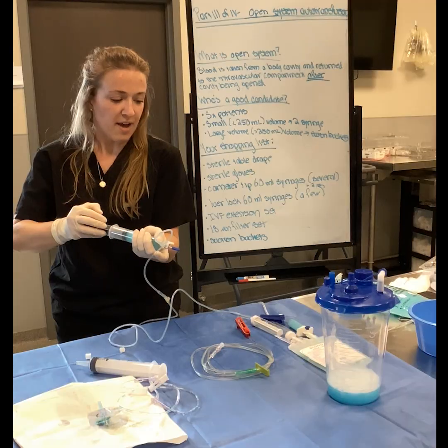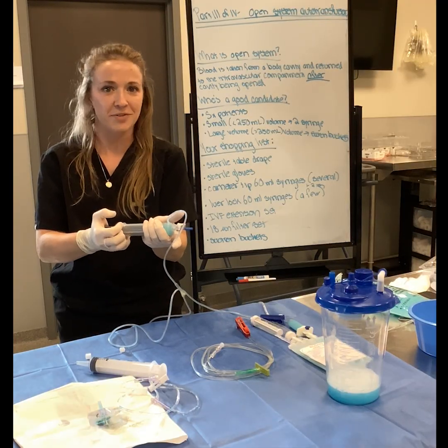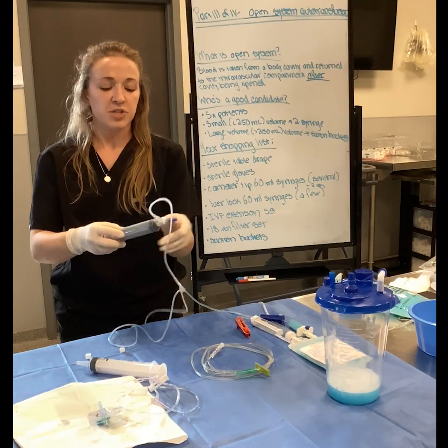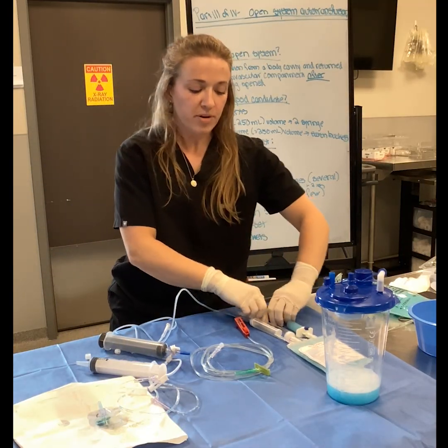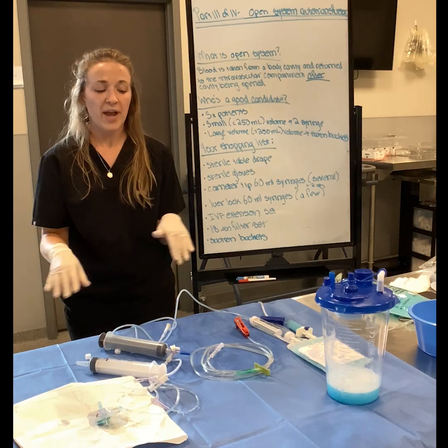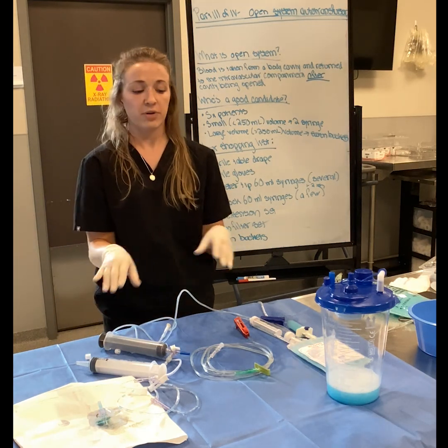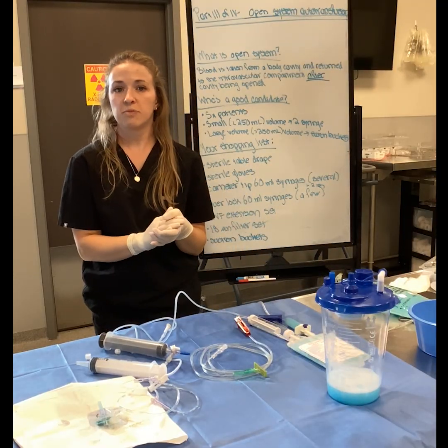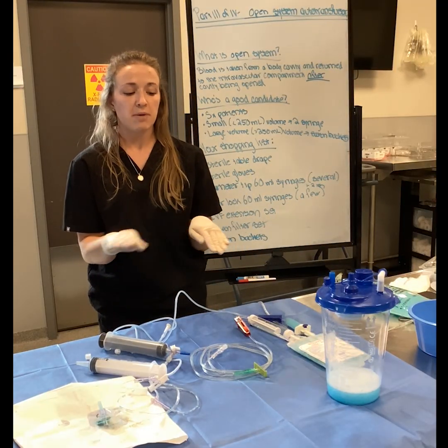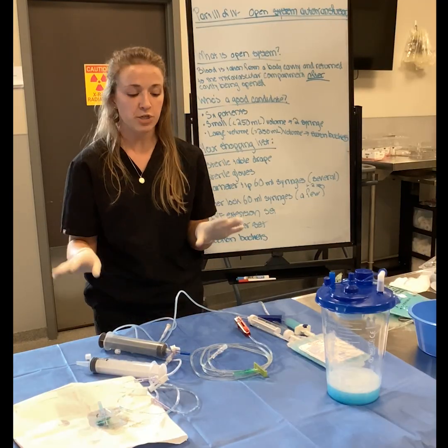I just want to get enough of this blood into the bag so I can show you that it drips out the other side. Okay, so let's pretend that I filled up my bag. Now, remember that if you're using bags with anticoagulant or you're adding that in yourself, you do need to be wary of the syringe count. So this particular bag can accommodate around 240, 250 mils of blood. So that's the amount it's rated for. So just keep an eye on it and you will be just fine.